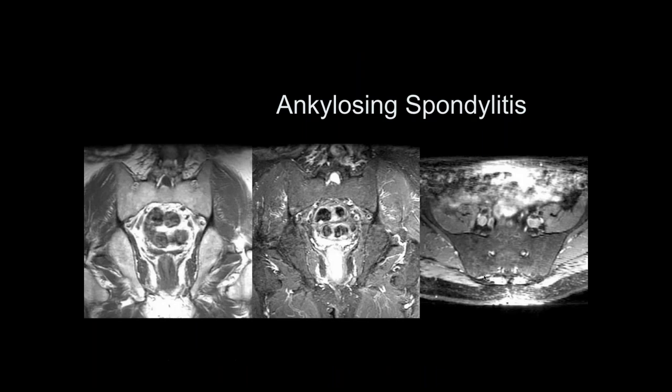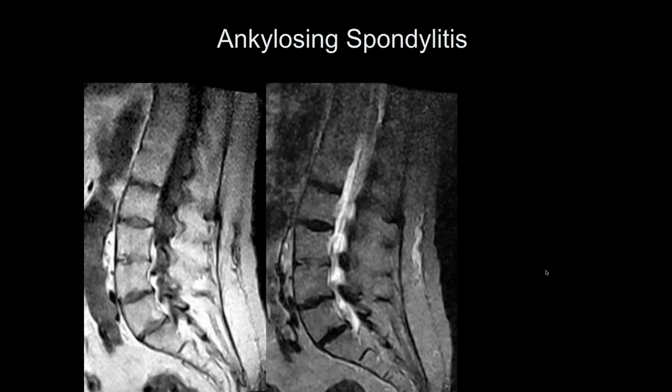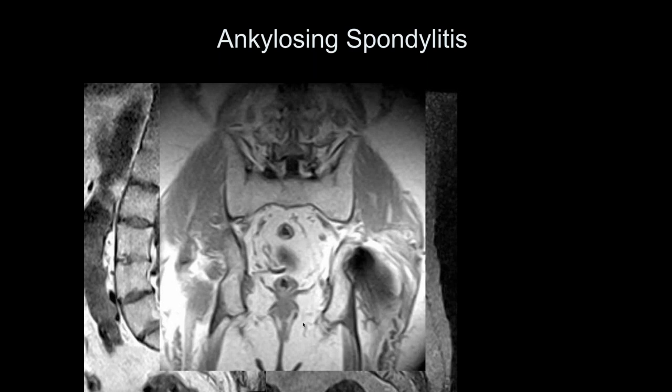Here's a more end-stage case with complete fusion of the sacroiliac joints. These vertebral bodies are completely fused — both posteriorly and anteriorly — as is the sacrum. This is end-stage ankylosing spondylitis. These diseases can also affect the zygapophyseal joints posteriorly.